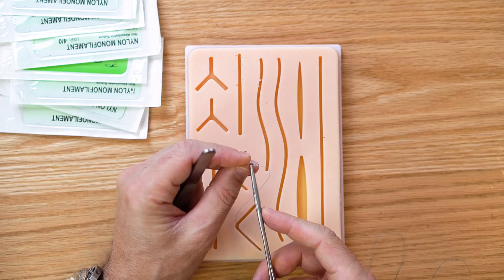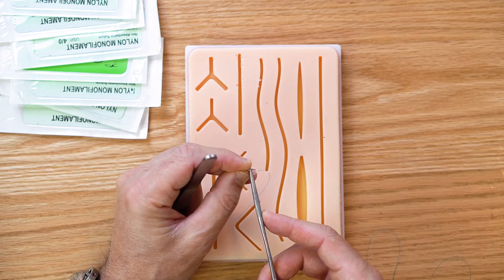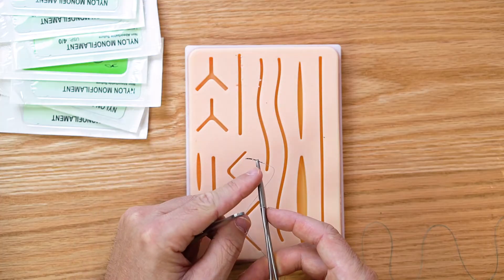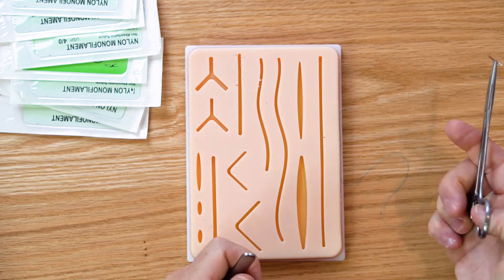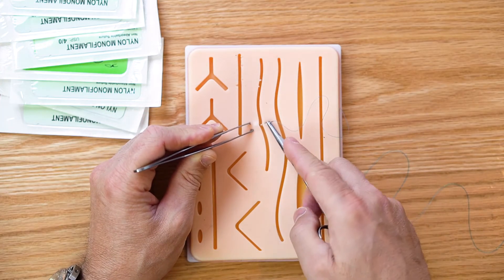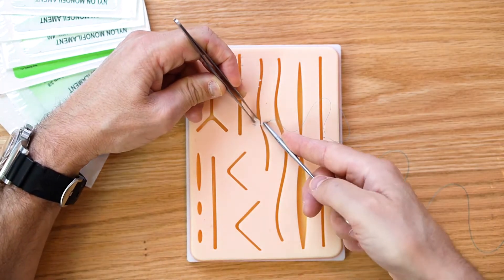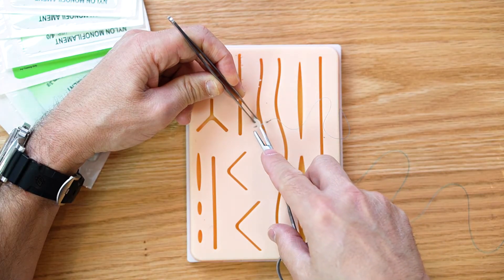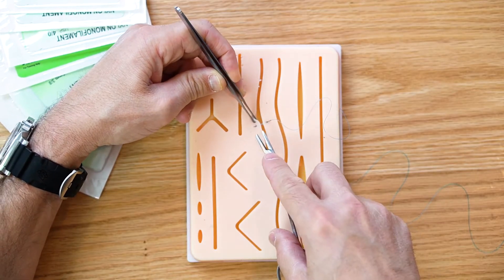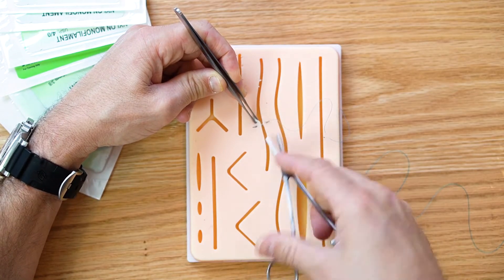We're going to do some hand ties, but first I have to put a couple sutures in here so we can tie them. Quick review: get the needle at about a 90-degree angle, at the tip of the needle driver. I like a little angle — most people do 90. Two-thirds of the way back on the needle. Grab the Adson like a pencil, not like this — like a pencil. Thumb and ring finger, or you can palm. Put the needle in, try to get 90 degrees, turn your wrist, come out. Go across the same level, the same depth, then turn your wrist again. Get that needle out. Hold the tissue so the needle stays steady.